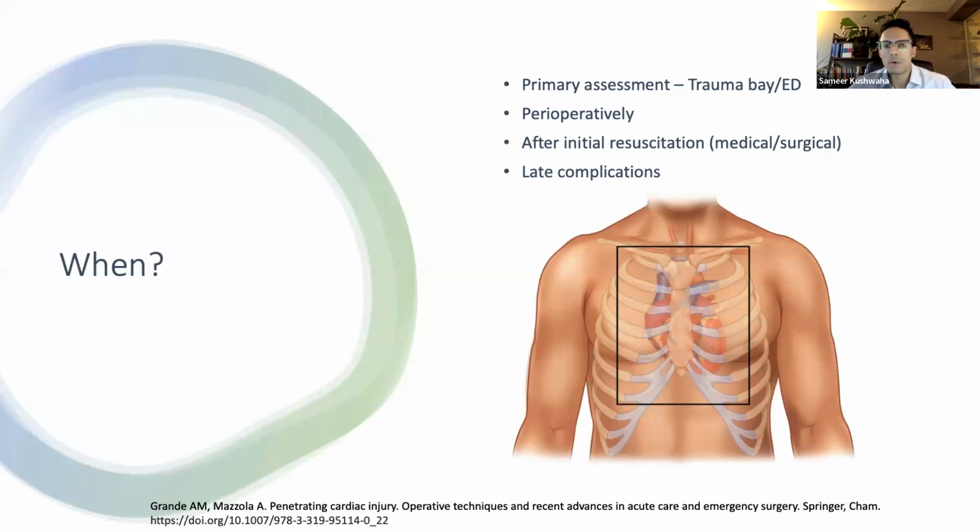We use echo at various different parts during the care of a patient with trauma. It's used even in the primary assessment, in the trauma bay, and in the emergency department. We, as cardiology and internal medicine physicians, are less commonly involved at this point, but on occasion we do get called to the trauma bay. Our anesthesiology colleagues and emergency colleagues, however, use echo very frequently in the trauma bay to assess patients.